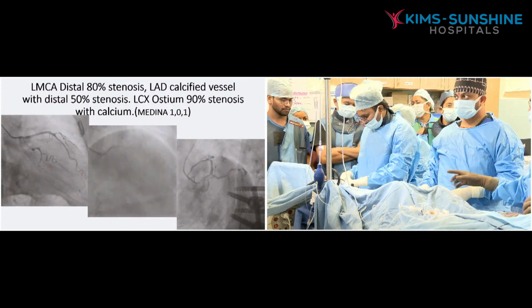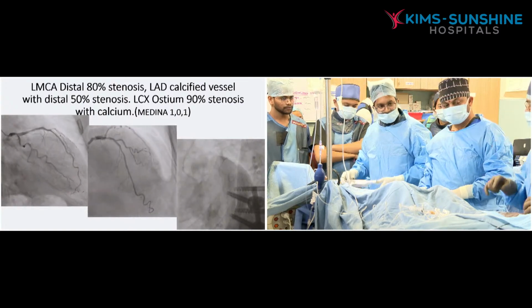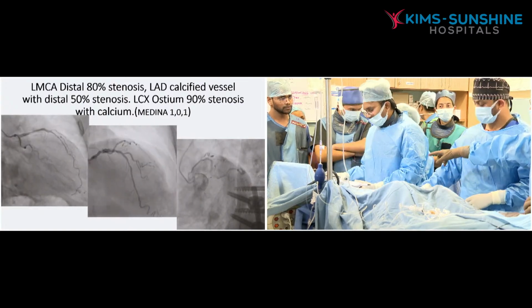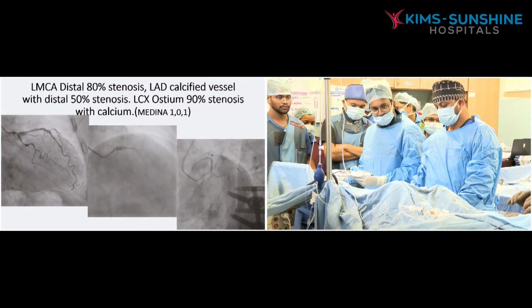When we are doing it, same, suppose when we are advancing, if a catheter is getting disengaged, pull the wire like exchange. No need to touch that one, only keep the burr straight. Burr straight, that's enough.